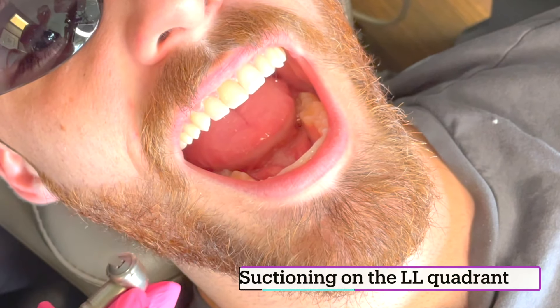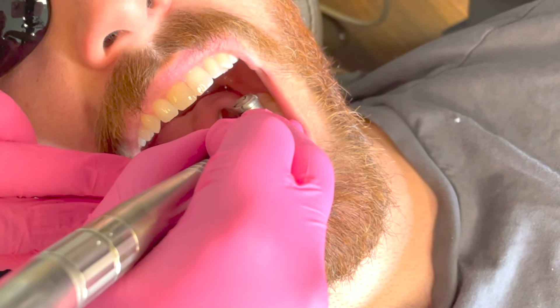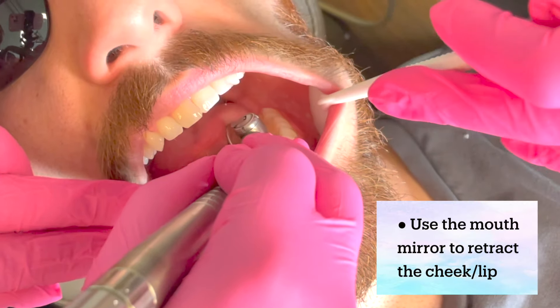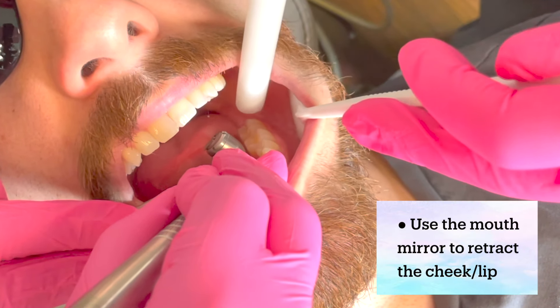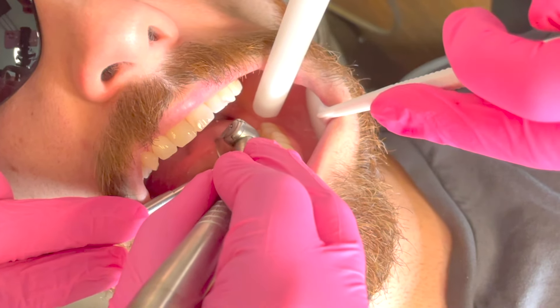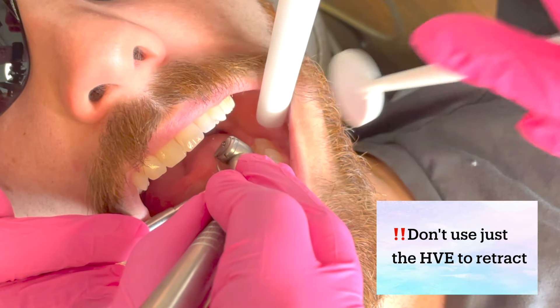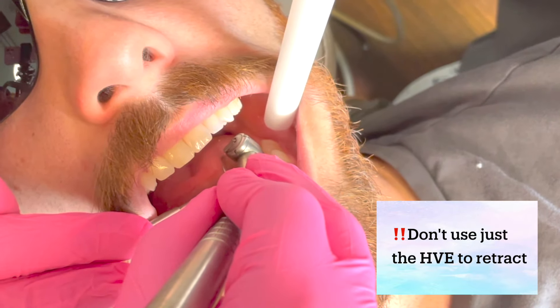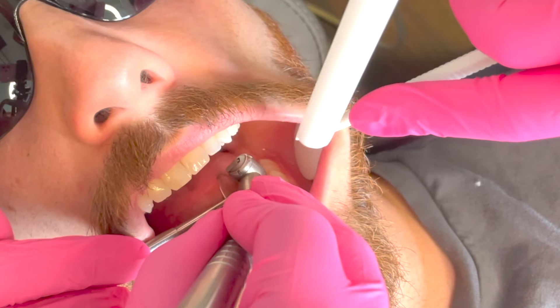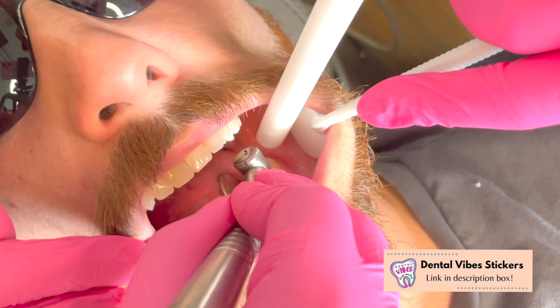Now we're going to the lower left — a little bit more tricky. We're going to retract the lip and the cheek, and I'm going to position my suction right there, while the doctor will be retracting the tongue. If you don't retract anything and just go in with your suction, you're going to start suctioning the cheek — it's going to sound loud, it's going to be a mess, and it's uncomfortable for the patient. So always have your mirror ready, retract, and your suction goes all the way to the back.